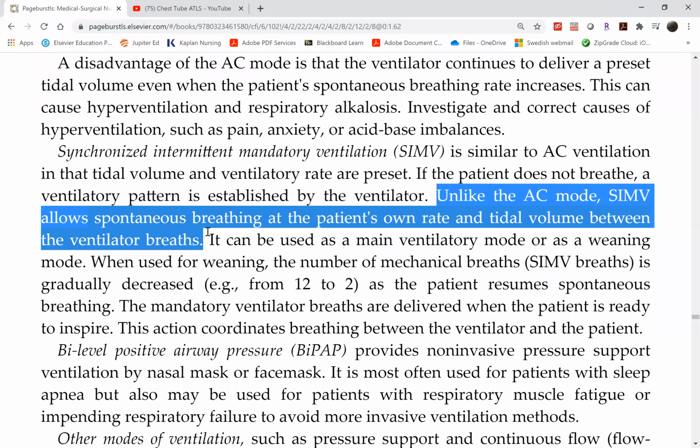Okay, thank you. Because one thing, again, the patient's lung compliance changes, right? So just because there's a preset tidal volume doesn't mean the patient will get the preset tidal volume. On the screen, you'll see the set tidal volume, and then right beside it, how much did the patient's lung allow? Does that make sense?